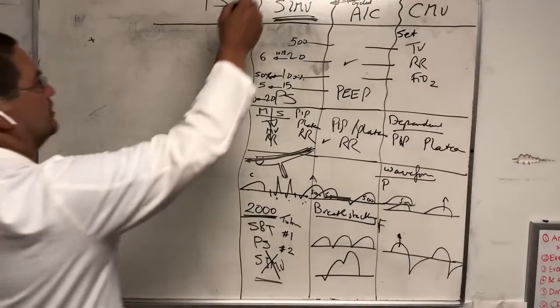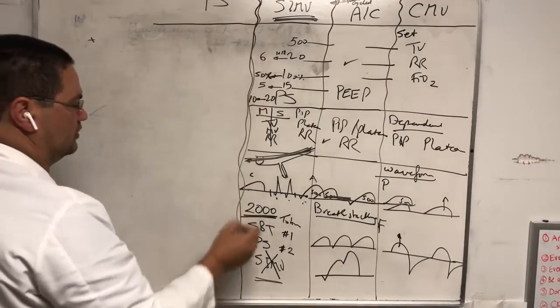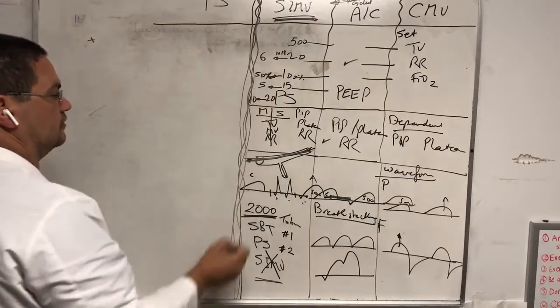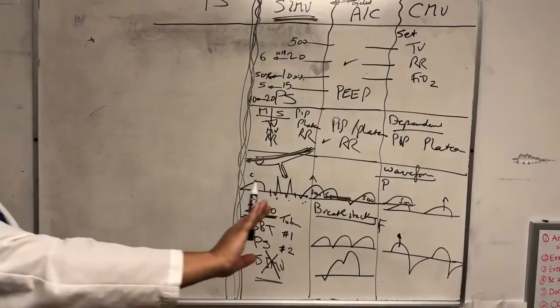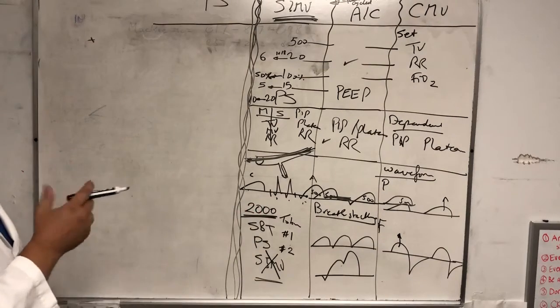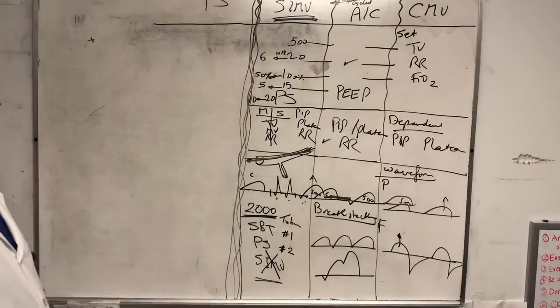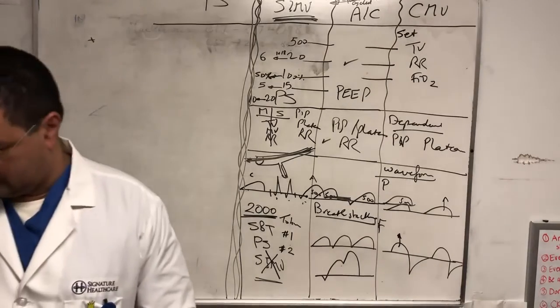All right, so we're done with the obsolete modes of ventilation. Any questions on those? Right? These we consider them obsolete. Now we're gonna start working on pressure support, volume control, and pressure control. We'll do pressure support today, and then volume control, pressure control later.